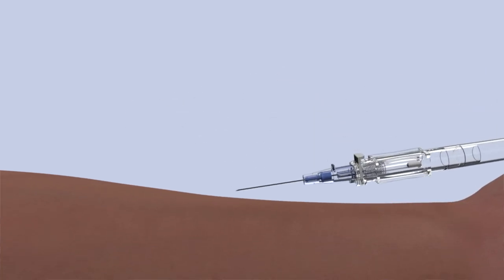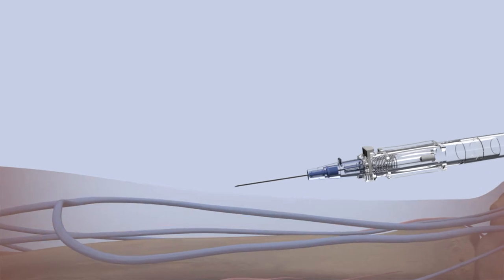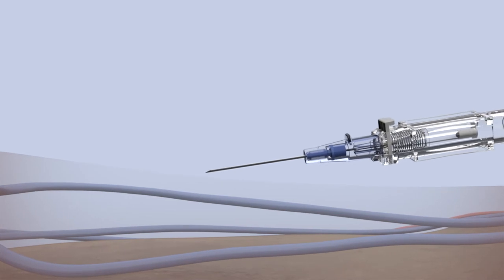Position the needle above the intended blood vessel. With the needle bevel facing up, pierce the skin.